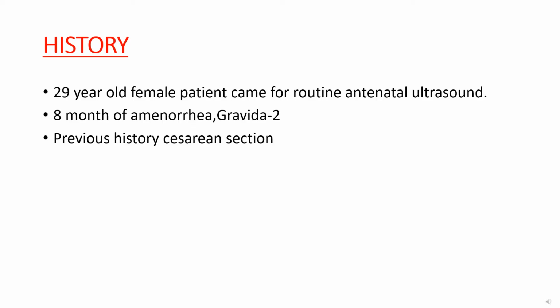History: 29-year-old female patient came for routine antenatal ultrasound, second gravida and 8th month of amenorrhea, with previous history of caesarean section.